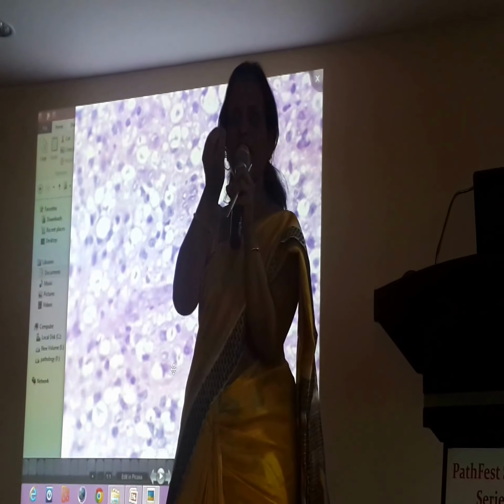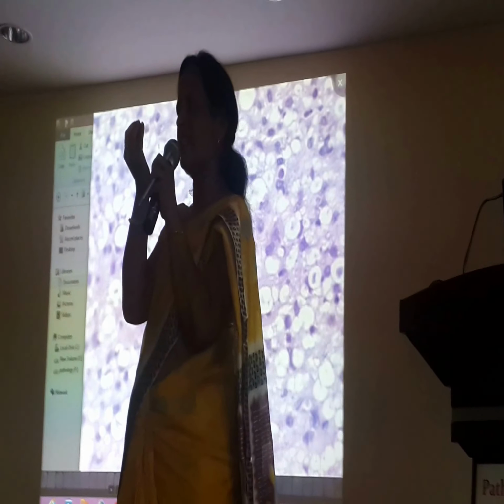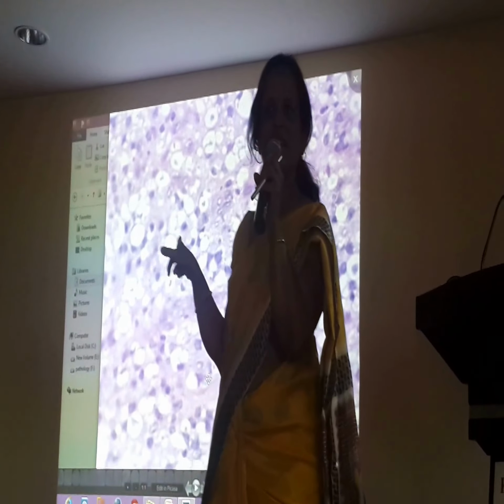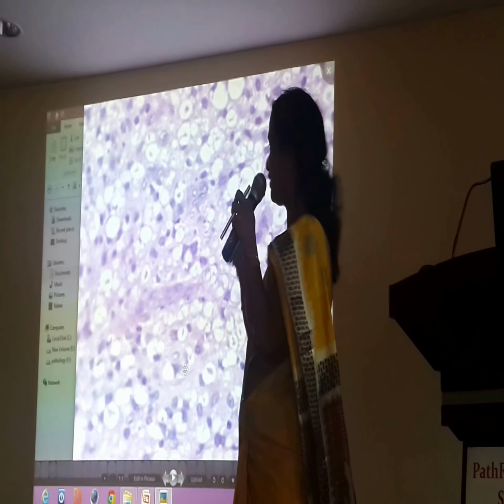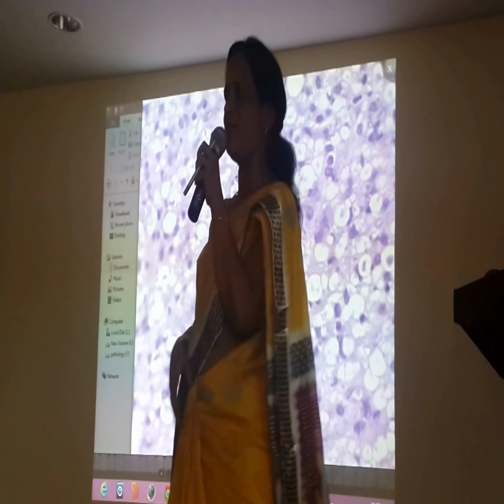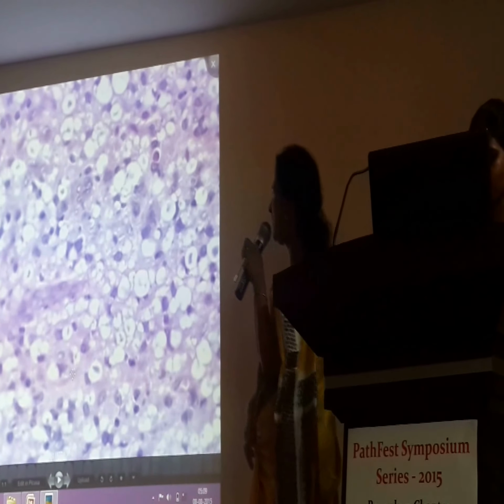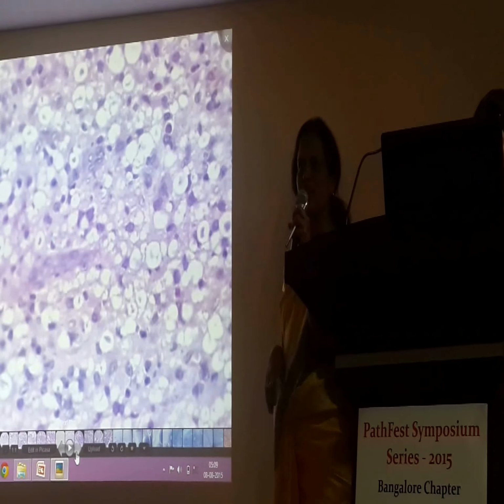That eosinophilic, slightly bluish appearance, the globi which are there within the cells. The degenerated bacteria give rise to that appearance. Pink material that you can see within the lymphocytes, but within the macrophages. So the morphology tells you, but I agree, you need to do a Ziehl-Neelsen. When you said Ziehl-Neelsen, probably looking at the macrophage, I thought you had that in mind. Yes, so these macrophages have the typical morphology of lepra cells.